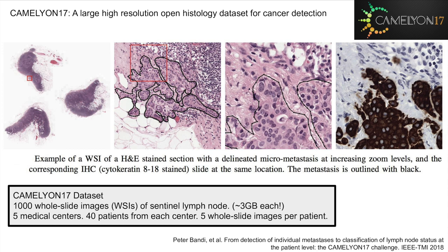In the example here, you can see the resolution of these images is very large. The segmented area is verified using a stain that highlights this cancer.